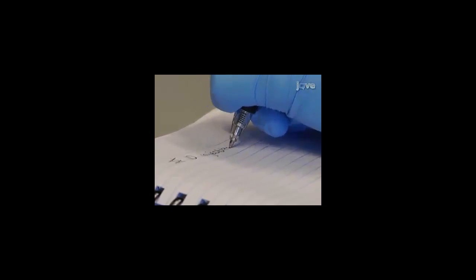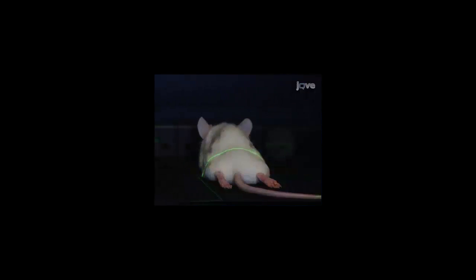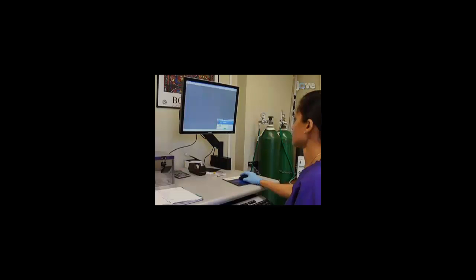Place the anesthetized animal dorsal or ventral side up on the imaging stage. Position the animal's nose in a nose cone to maintain proper anesthesia induction. Make sure the animal is within the point of interest grid as indicated by green illumination. Set the imaging system to the appropriate settings. Be sure to initialize the system before acquiring the first animal image.